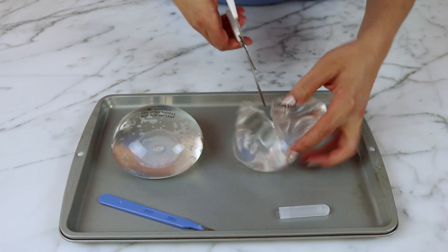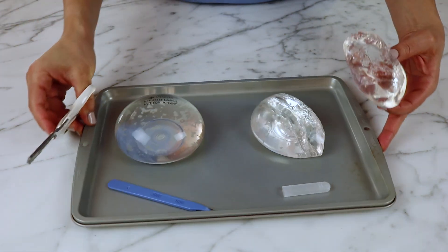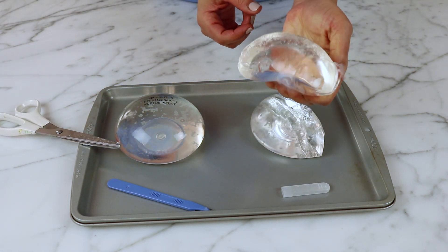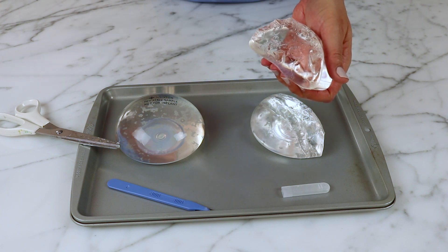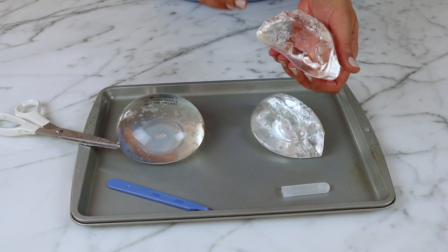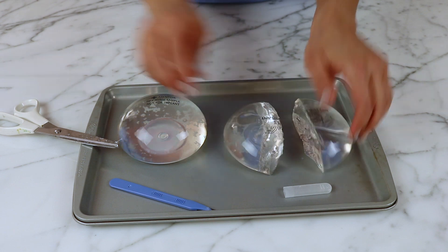You can see on the inside there is a gel. Even if you squeeze the implant, it goes back to its original shape. This is why we call them cohesive — because they retain their shape. People tend to call these implants gummy bear implants because when you cut them on the inside, it looks like a gummy bear.